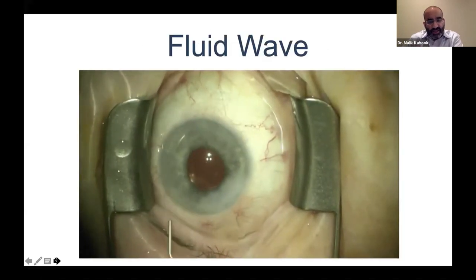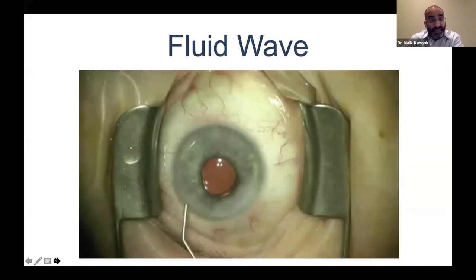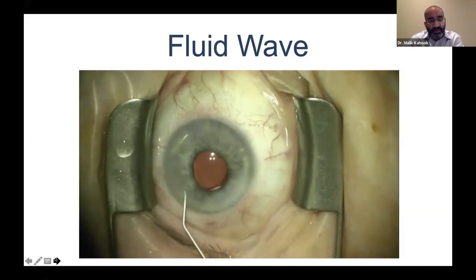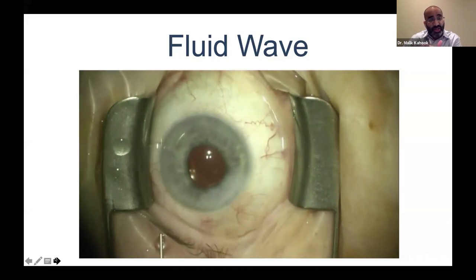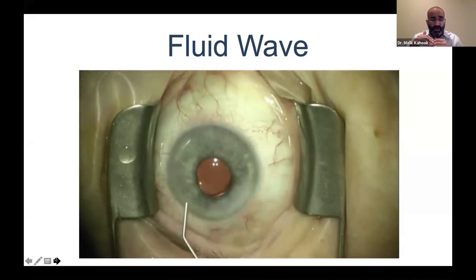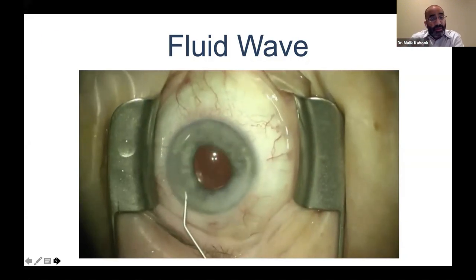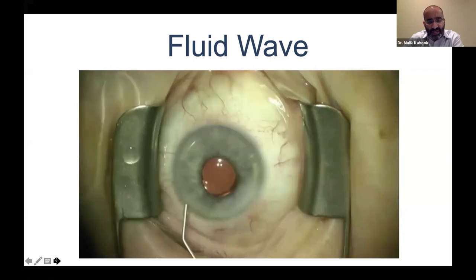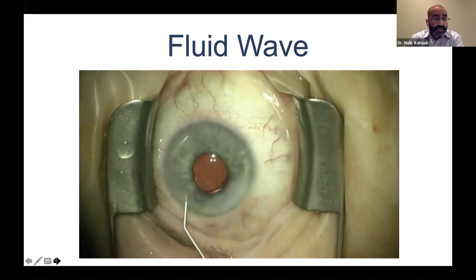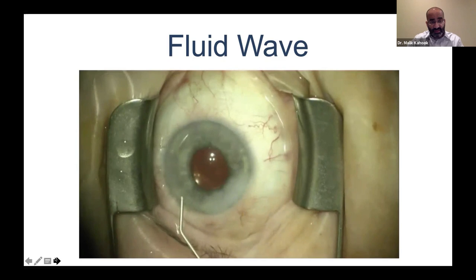At the conclusion of most angle procedures, we like to blanch the vessels if at all possible. You can see surface vessels blanching when we inject BSS into the eye — inflating the anterior chamber, increasing pressure, increasing outflow. This is the sign we're looking for post-procedure. In this case, post-goniotomy, we've unroofed three or four collector channels, and the blanching is significant — always a good sign that the distal outflow system is patent.